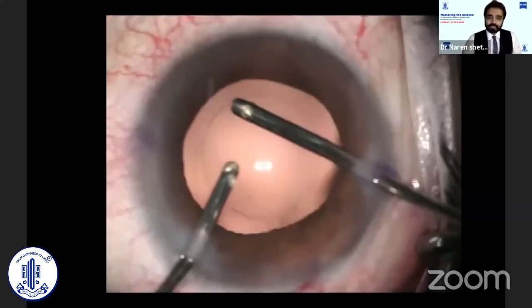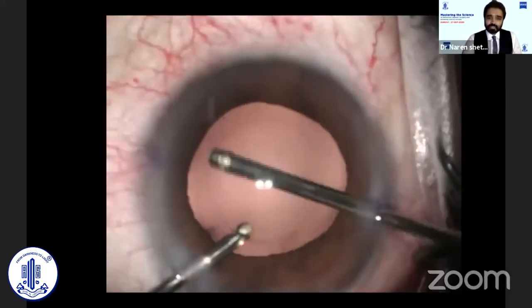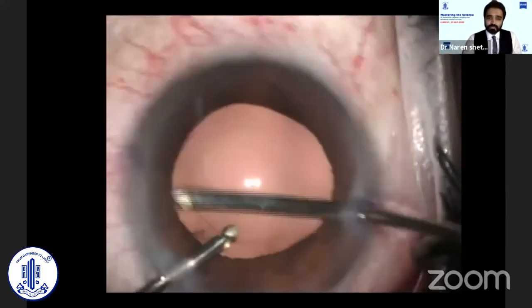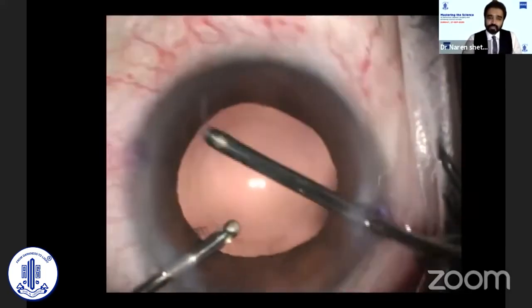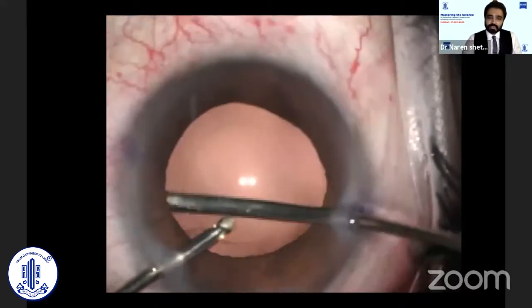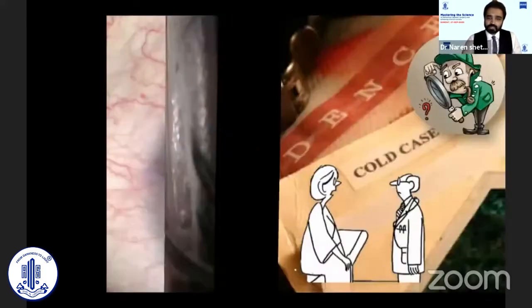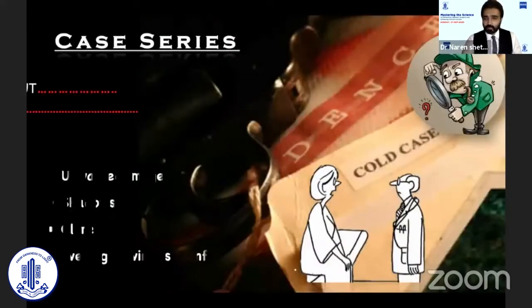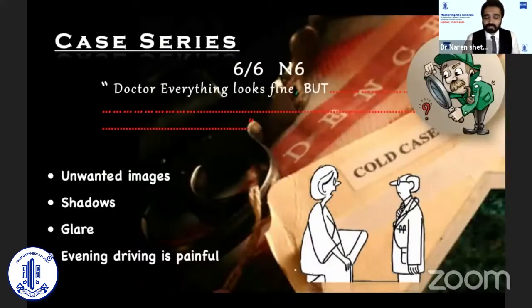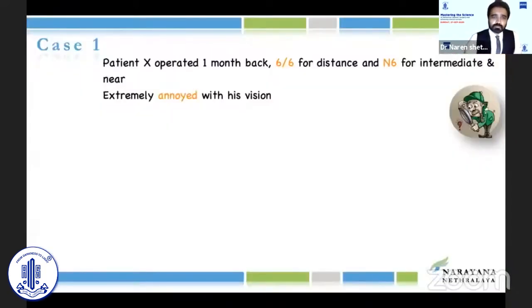One more suggestion: I would really suggest everyone to try to polish the anterior capsule. This would really improve the visual or optical quality of the eyes post-implantation of all these trifocal IOLs.